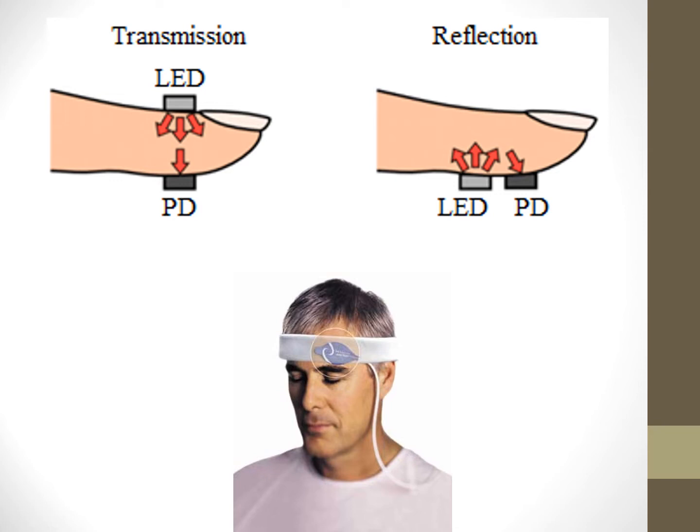If they're vasoconstricted in their fingers and their toes, and they're cold and hypothermic, which one's going to be more accurate? The one on their finger or the one on their forehead, right? So the reflective one could actually be more accurate with hemodynamically compromised patients. Low blood pressure, think reflective pulse oximetry.